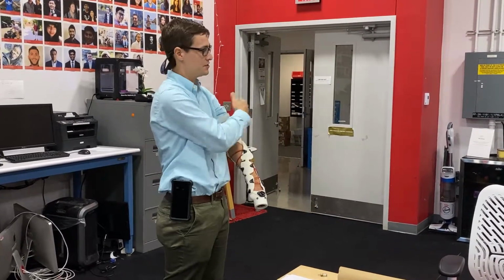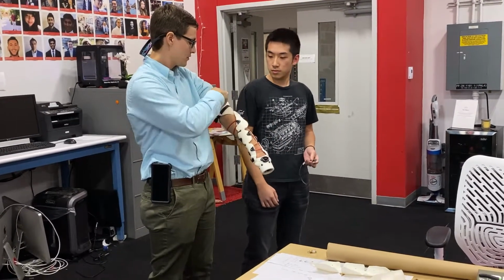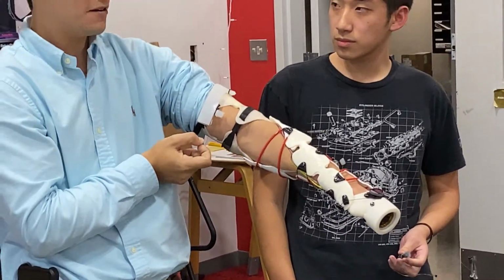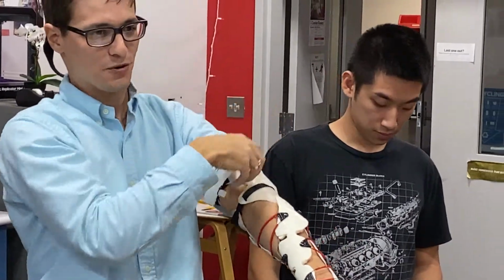In the lab that he's working in, we are working on a wearable device. This is the first prototype you might have seen last year. But we're working on a second prototype to allow the volume to fit around the whole entire arm versus having a single bowl. Because one issue that we found is if you overstimulate, these things will blow up as they're silicone and they will pop. So we cannot have that happening.